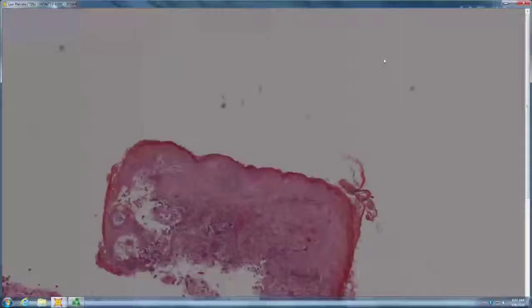And then very commonly it gets into the epidermis and mimics Bowen's disease. So if you're on the eyelid and you have something that looks like Bowen's disease, think sebaceous, get some kind of sebaceous marker. So what kind of markers can you use for sebaceous differentiation? I think like something with glycogen. That's more tricholemmal differentiation.